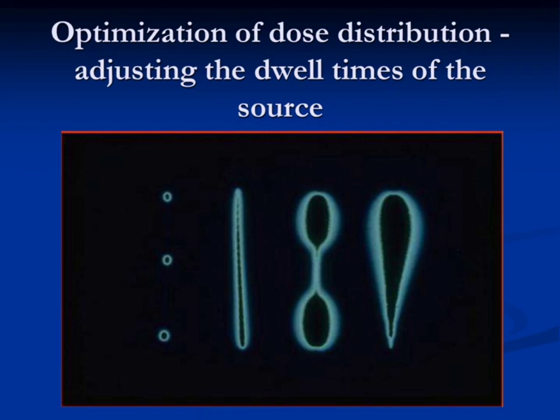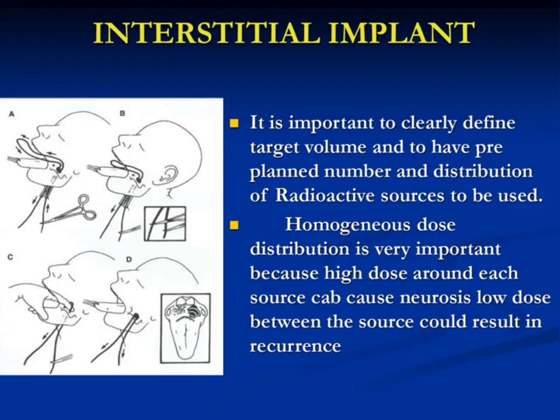It is a remote afterloading cesium machine, which is now probably not practiced anywhere. These catheters are connected to the applicator and the source movements happen accordingly. So it's basically a cervix patient receiving brachytherapy after external beam radiotherapy.